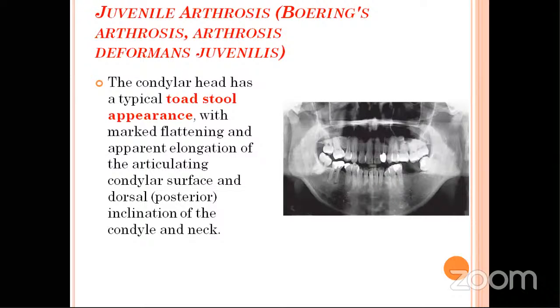So toadstool means a mushroom. Okay, so this is the toadstool appearance which is seen in young patients, where there will be flattening and elongation of the articular surface of the condyle.